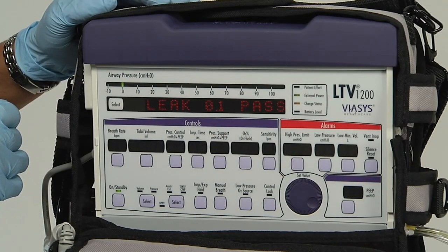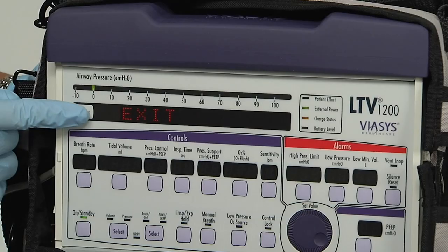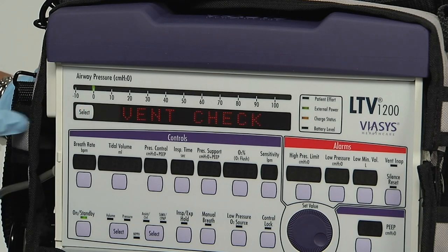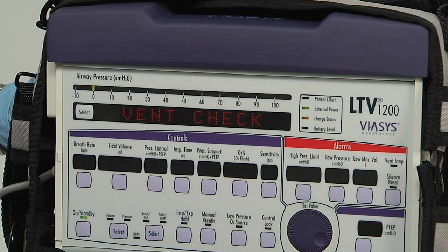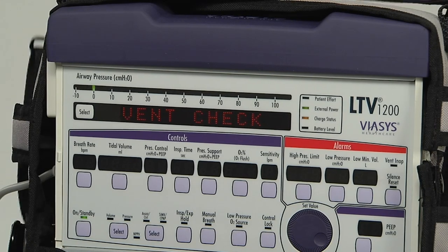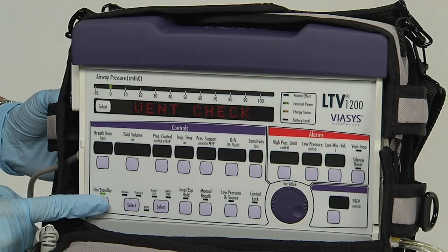To exit the leak test, push the select button again and the next menu item is displayed. Next, we'll perform the vent in op alarm test. Use the vent in op alarm test to verify that the in op alarm is working correctly. To perform this test, you must turn the ventilator off by pressing and holding the on/standby button for 3 seconds.